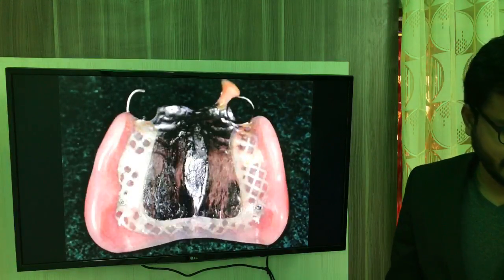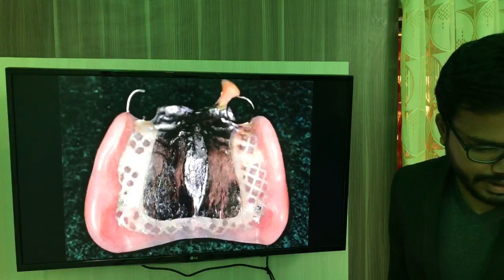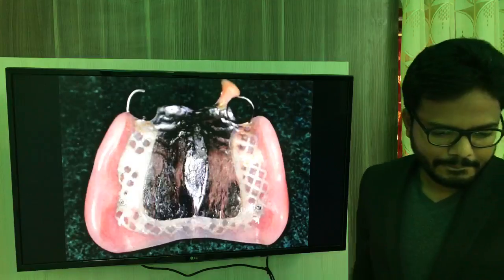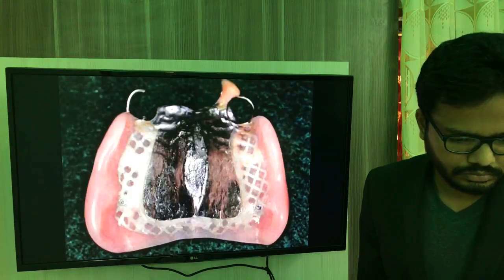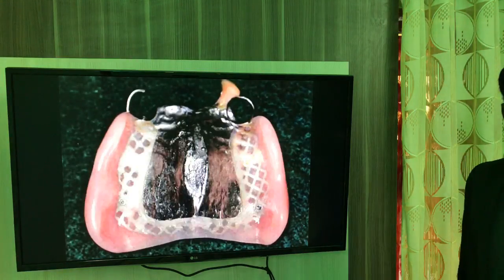And you have this. So what does this image represent? There is complete coverage of palate. Yes, Preeti, Abhishek, Urvil.